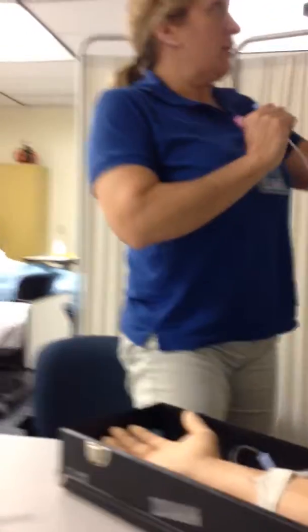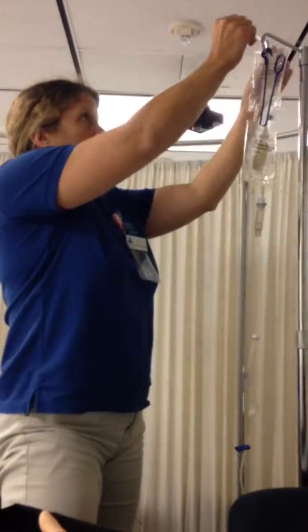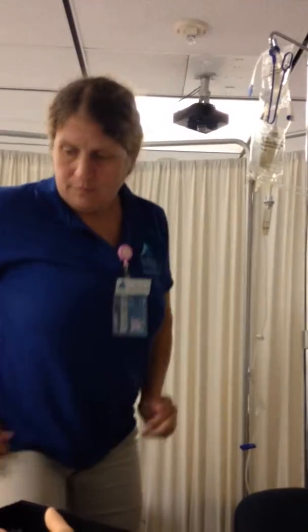You can't do this. You're going to have to remove this. The old one isn't connected anymore. Why does it matter? This is still sterile. Because it's still your primary.